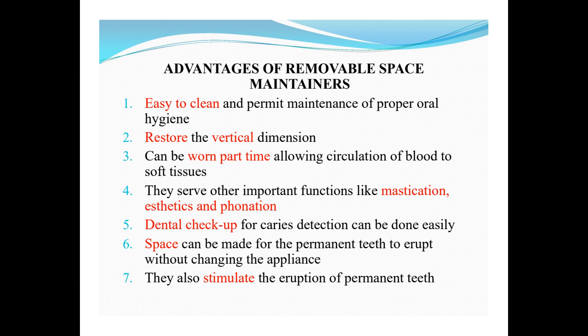What are the advantages? Because it can be removed, it is very easy to clean. So the oral hygiene of the child is maintained. It restores the vertical dimension because you're going to add an acrylic or the artificial teeth, so the vertical dimension of the patient is maintained. It can be worn part-time. Suppose you wear it continuously, what happens? Tissue irritation happens. But this removable space maintainer can be removed, so it can be worn part-time. It even serves other functions like mastication because we have artificial teeth. The child can eat properly, can chew the food properly. The phonetics is good, the speech is improved, everything.